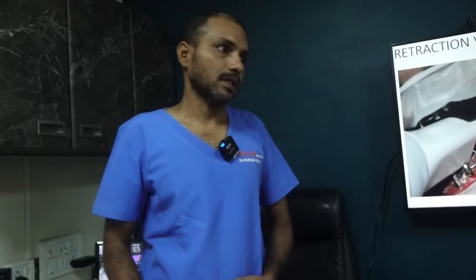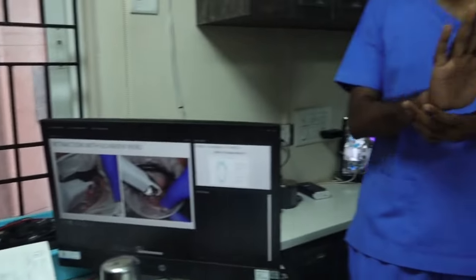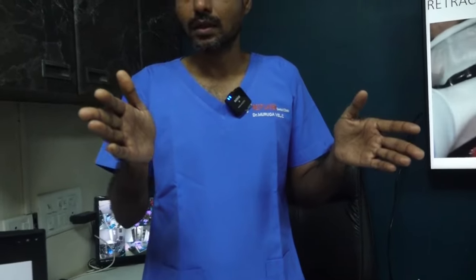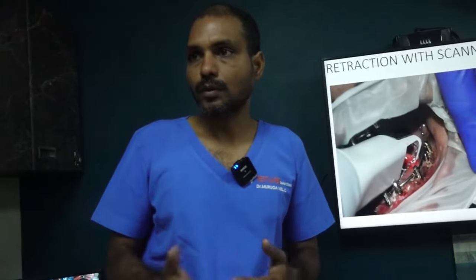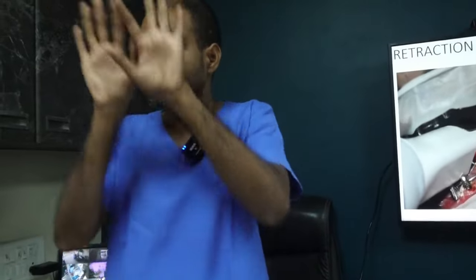Before starting this, you have to prepare the patient mentally. Tell them: we are going to take a digital impression of your implants. For that, we need to retract your lip and cheek, and we won't be retracting them with fingers. We will be retracting with this material, and there will be some discomfort. If you pre-inform them, they will be mentally prepared. Otherwise, while scanning, when you are pulling, they will push your hand away and stop you, and then you have to start again.